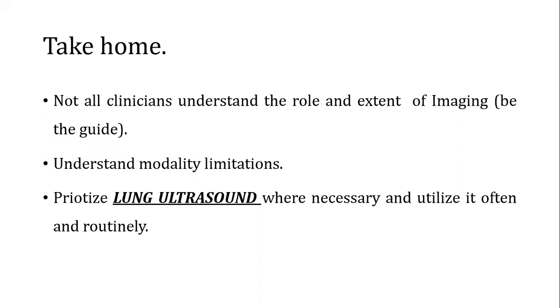Is lung ultrasound about to replace the chest X-ray? Certainly not. We know in all imaging, the biggest percentage of the examination that is done is the chest X-ray because it is the start point. But like we have seen, it has its limitations. We could not demonstrate how much pleural effusion there was. But we saw in the ultrasound, it's much more than what one could imagine.